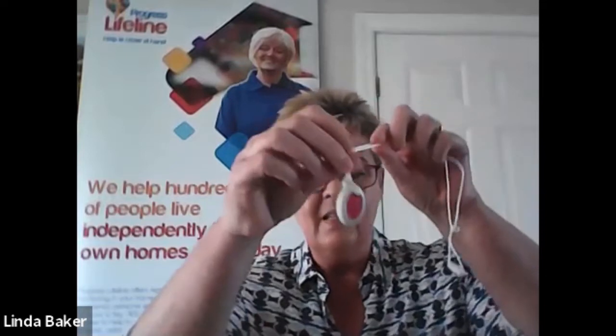What I'd like to do is tell you a little bit more about the Telecare services and what we do. If I may start with the in-house Telecare. Now, the in-house Telecare is a system that is set up at home, and you have access to our alarm response centre 24 hours a day, 365 days a year. You may be familiar with it, but there is a box here, which is a control box that plugs into your telephone socket. Attached to the box will be a red pendant alarm, which you may have seen in the past. When that red pendant is pressed, you get automatic contact with our alarm response centre. So there's always someone there for that bit of reassurance.